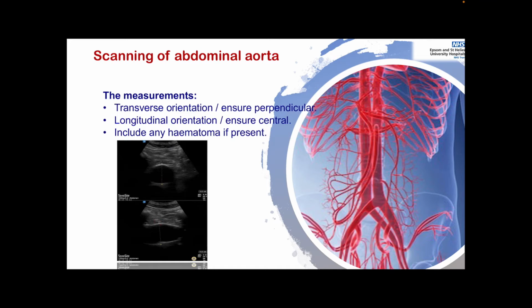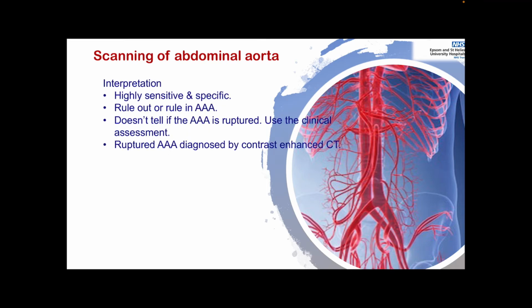And this is the transverse orientation, and this is the longitudinal orientation. And you can see here this is the way how to measure the wall or the diameter of the abdominal aorta.